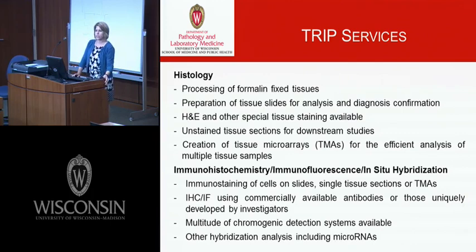Unstained slides for downstream studies can be provided, and we work with other entities on campus for the creation of tissue microarrays for effective and efficient analysis of multiple tissue types in a smaller surface area.